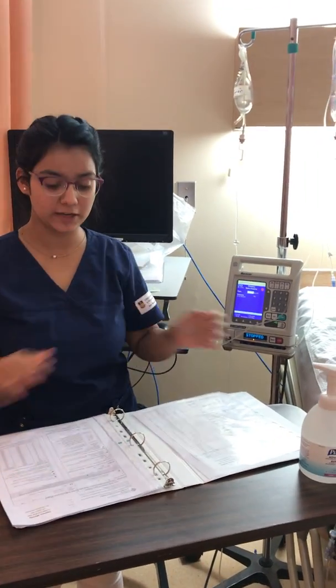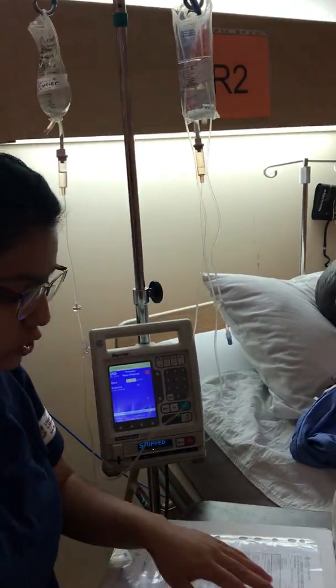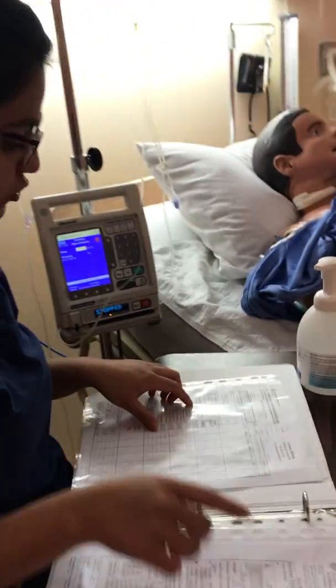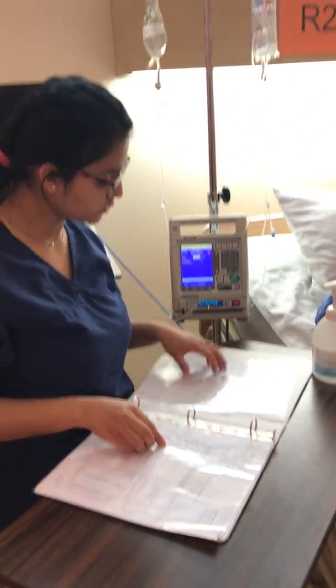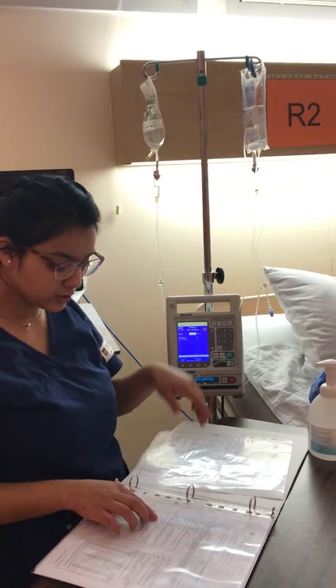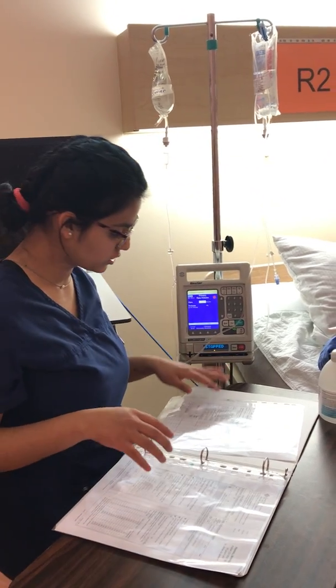We're going to start off by comparing our physician order, MAR, and our label. We have the right patient, Wendy. We have the right drug, which is heparin. We have the right dose, 25,000 units. We have the right route, which is continuous infusion. The right time is now, which is 8:30.